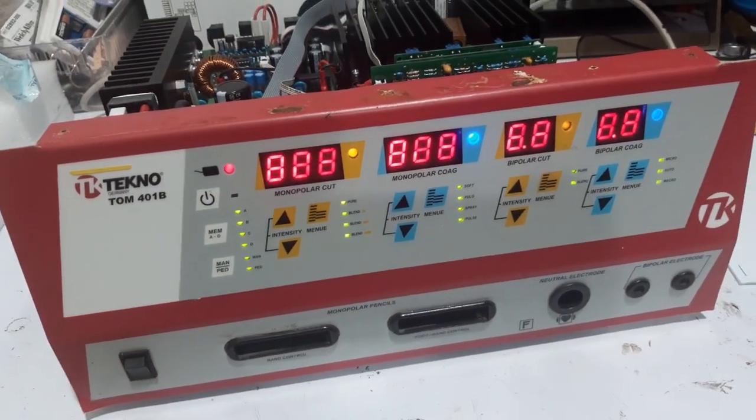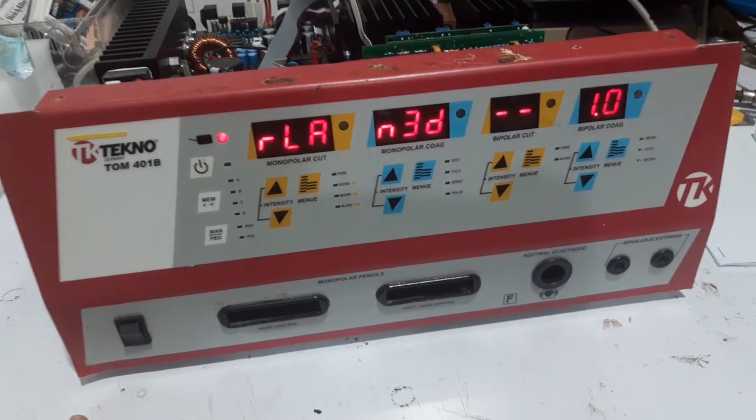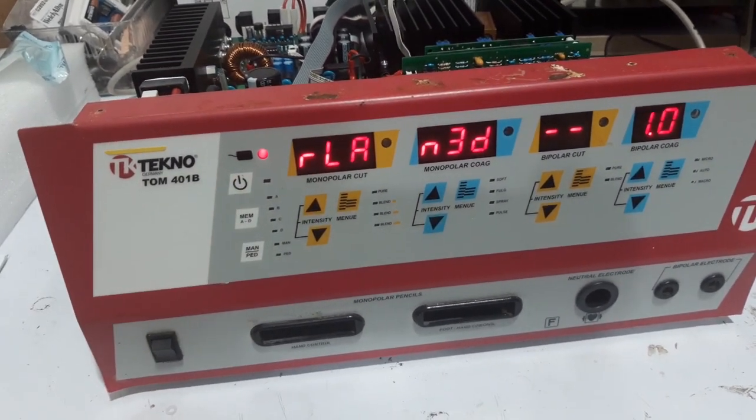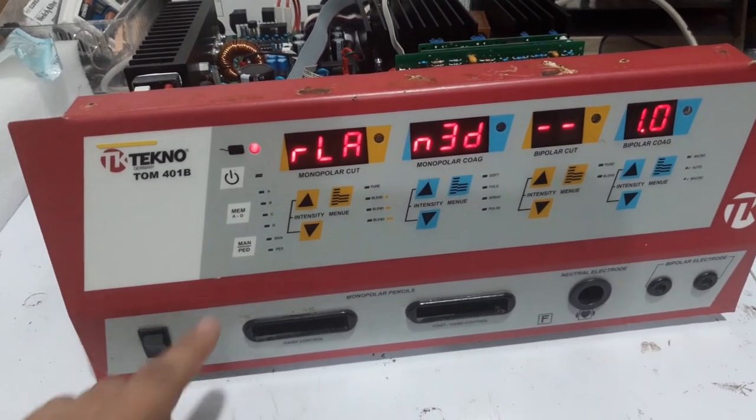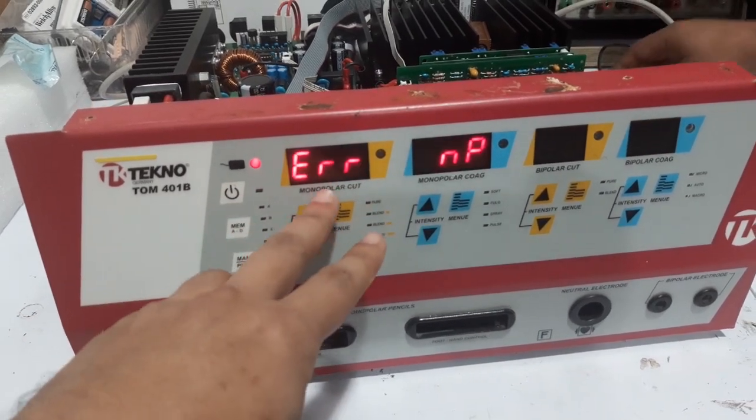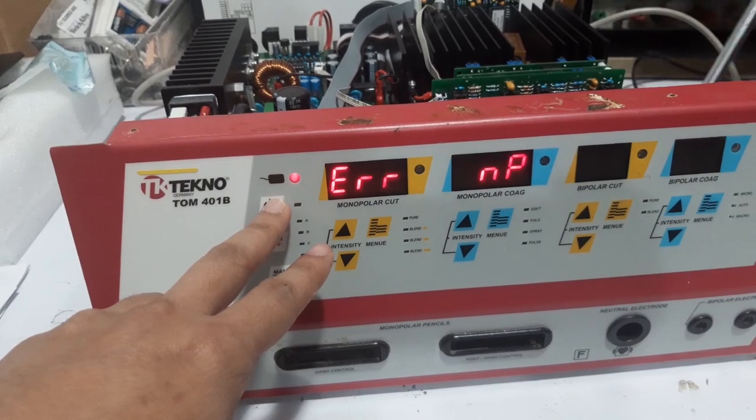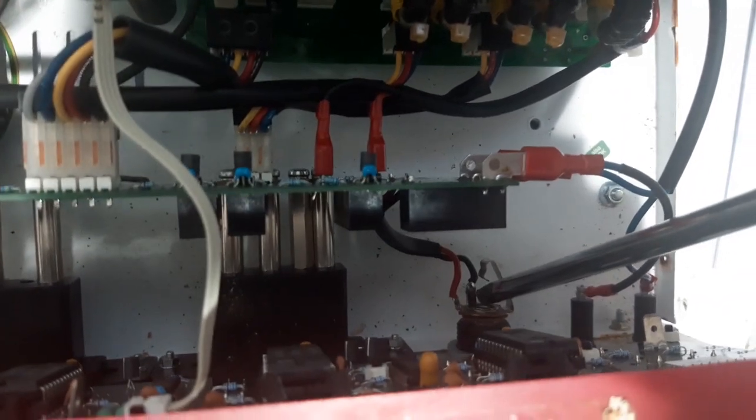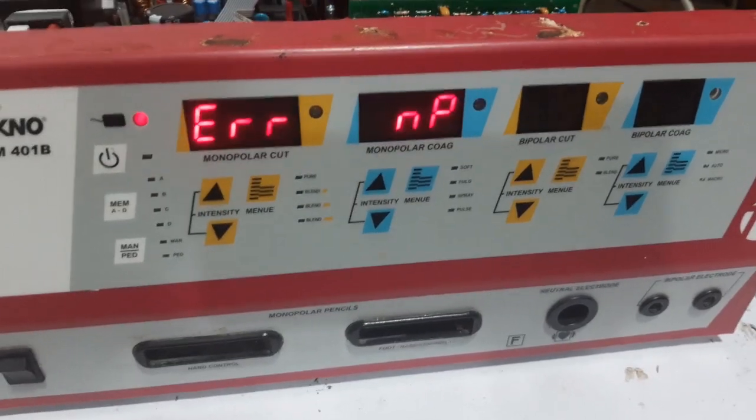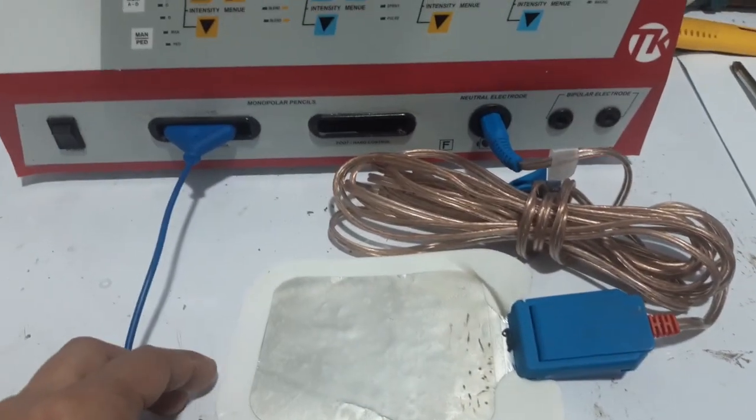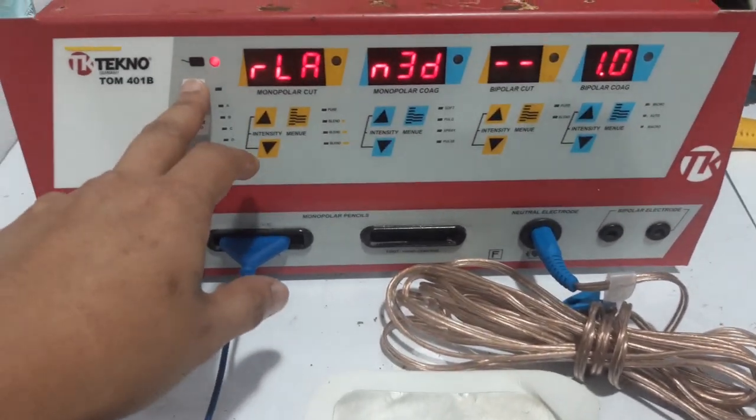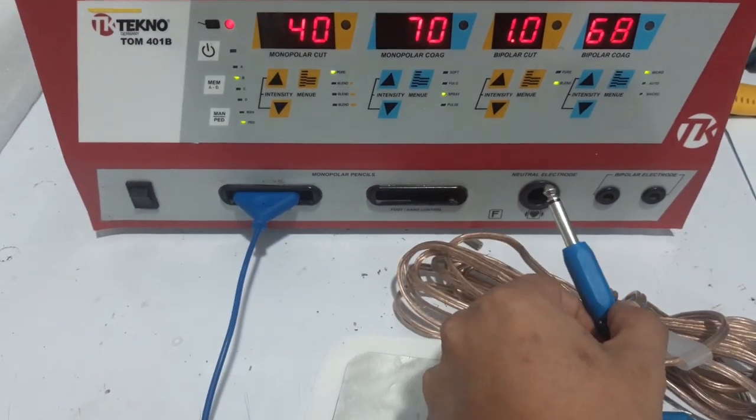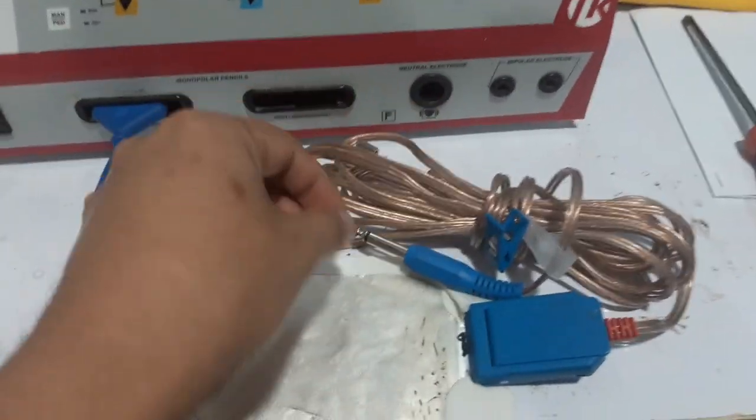We will turn the unit on now. Let's power up. This error you see is related to the neutral plate, so this is not a problem. Just to make sure it is okay, let's fix all the accessories. It's connected now and as you can see there is no more error. That error before was related to this neutral plate.